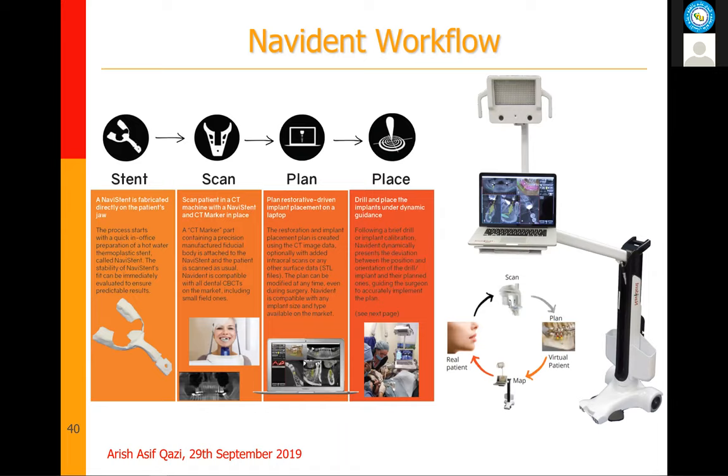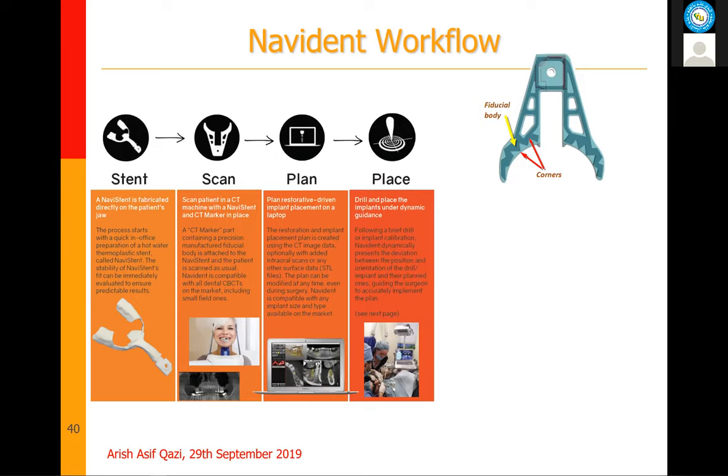This is what the workflow looks like. You start with the scan, you go to the plan, which is your virtual patient, your image, and then using this mapping or registration, you go to the real patient. So this is where the registration comes in. To register our system, we use something called a fiducial. We developed this; it's a piece of aluminum, and it has all these features. We spent a lot of time designing and testing this. Even if only three corners of this fiducial are visible in the scan, you would still be able to successfully and accurately register the data.